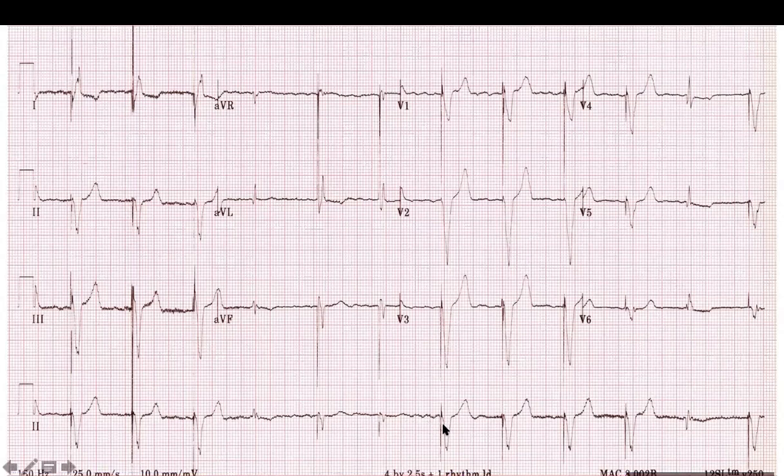And then we continue, you have pacing, pacing, pacing, pacing. This is a native sensed beat or the native beat, and this is another pacing. So, was this understood, the fusion beats, or not? Could you repeat it, Doctor, please? Fusion beats seem that the native QRS happened at the same time as the pacing.